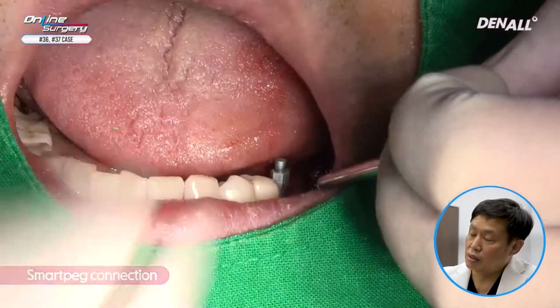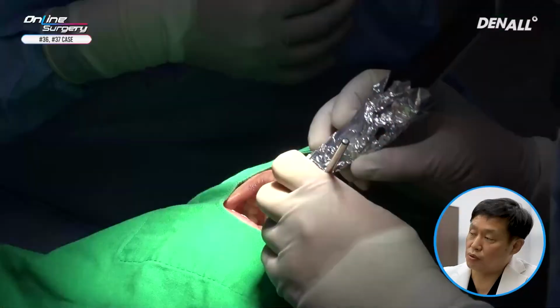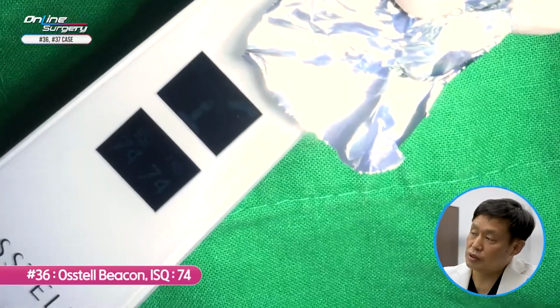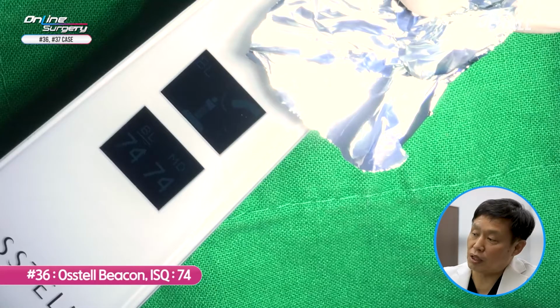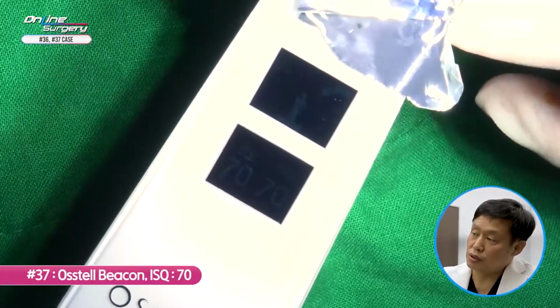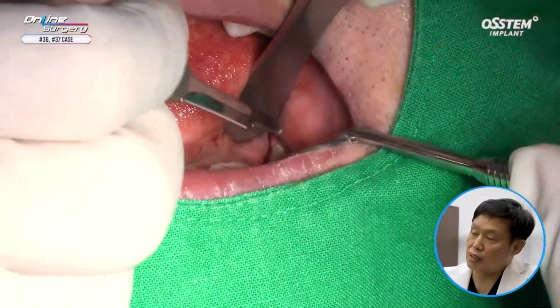Smart peg is connected. ISQ value is measured. In the case of number 36, ISQ is approximately 74. And for number 37, it's 70.